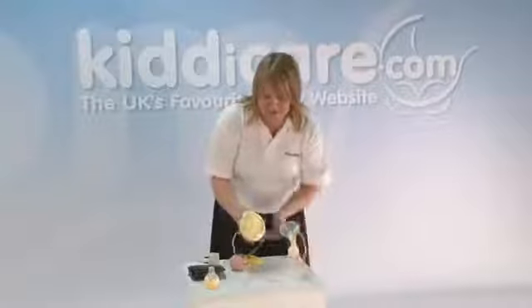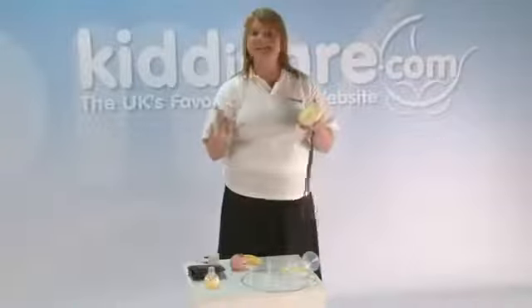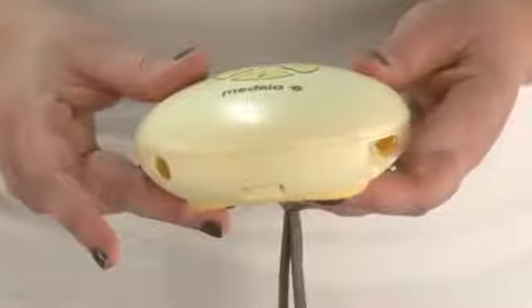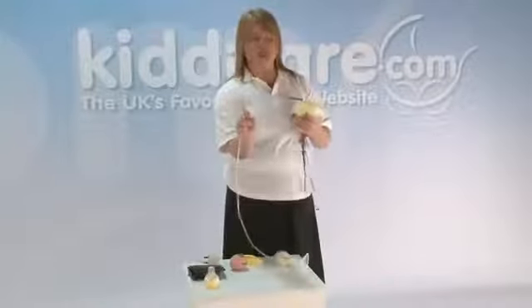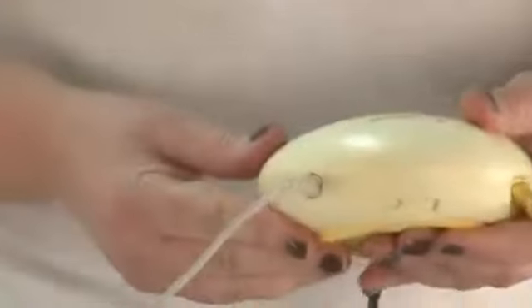We'll have a look now at the motor. So if I take the tubing off, what you've got here is your main motor unit, and as I said, it takes batteries or mains. So the battery pack is in here, so it takes 4 AA batteries. There are 2 holes on the motor unit, and it's really important to make sure we're putting the right thing in the right hole. The tubing has a yellow triangle, and you've got a yellow triangle on the hole there, so that's how we know that that's the hole for the tubing, so a good tight push. If you are using the mains, it's the other hole for the mains adapter.